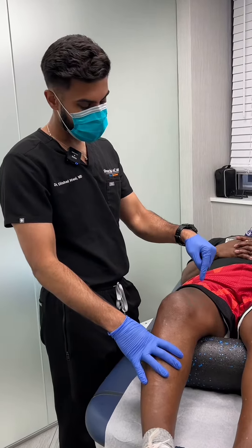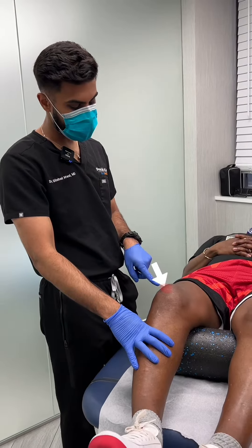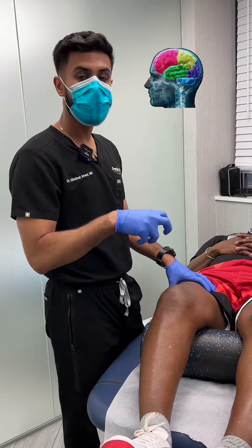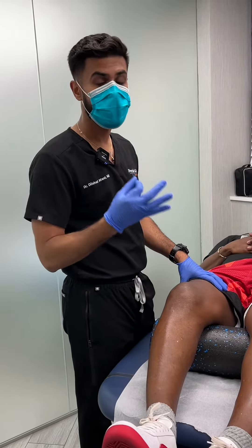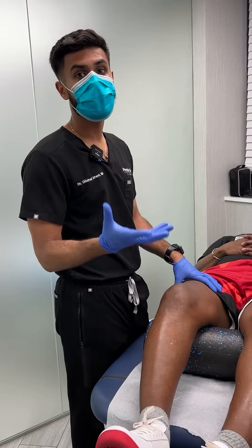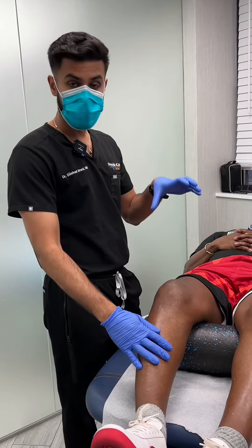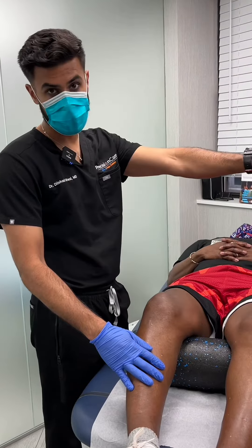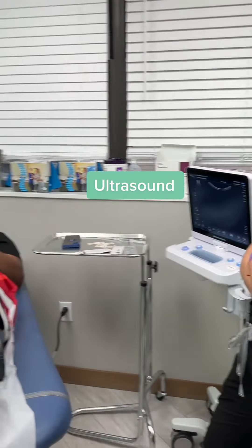One on the side in the middle area, one on the other side, and then one in the lower part of his leg. These nerves are responsible for sending a signal to the brain saying, I have significant arthritis and that's what's causing me my pain. What I'm going to be doing is putting numbing medicine, and I'm going to be using the ultrasound to guide me in going to the right location.